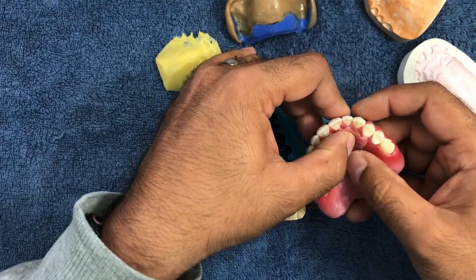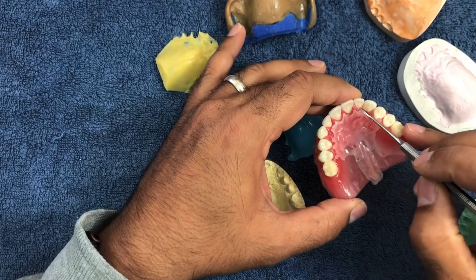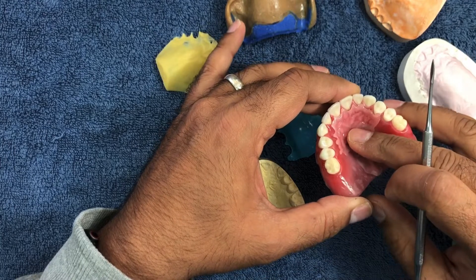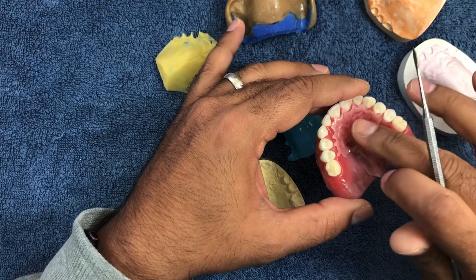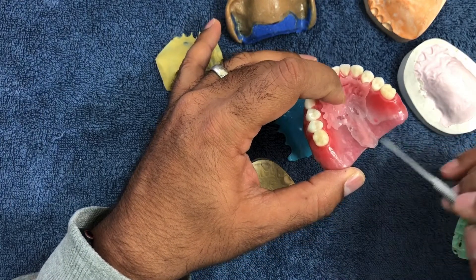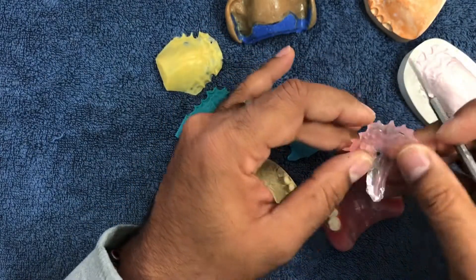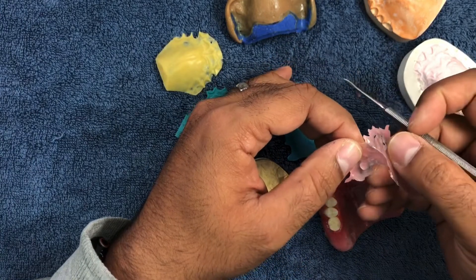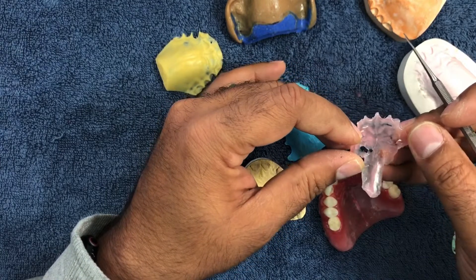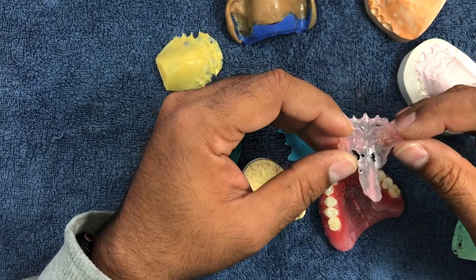I center it and seal it to that first layer of wax. Some people like to do two sheets of thickness, which is ideal, but then you don't have room to play with. This adds extra thickness, and then you can add a bit of wax on the sides and seal it, removing the excess. It's quite malleable, but if you overdo it, it bends and cracks. If you're planning to photograph your work, the cracks will show and it won't look nice — so be very gentle and careful.